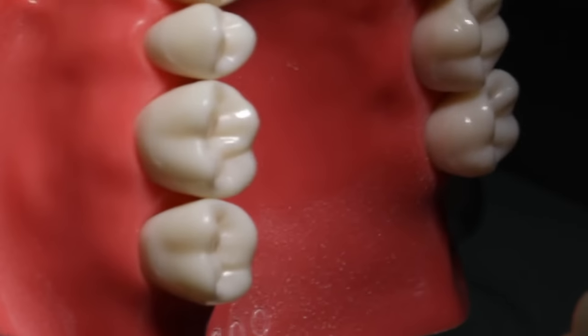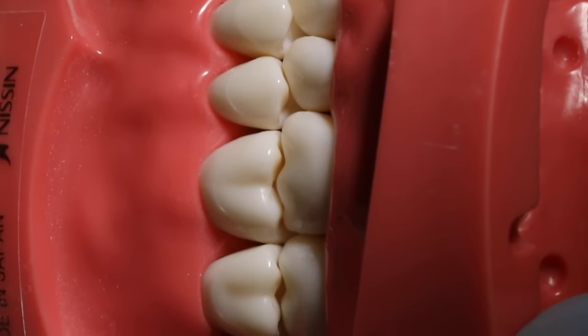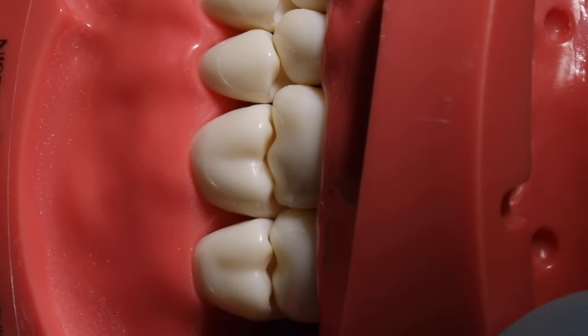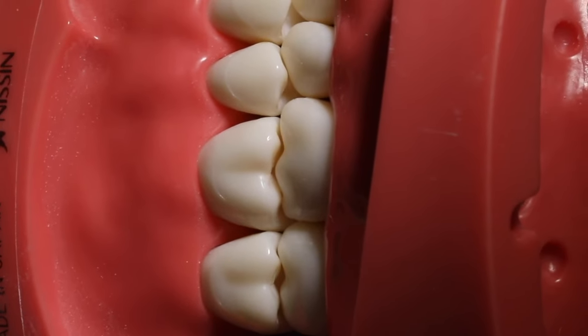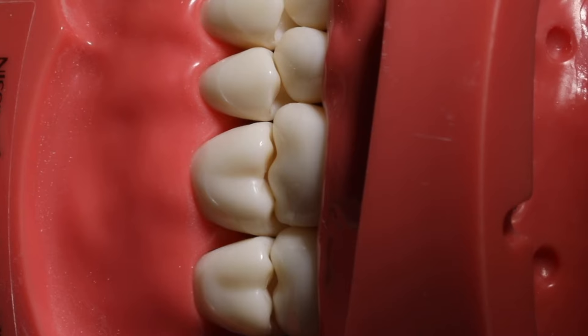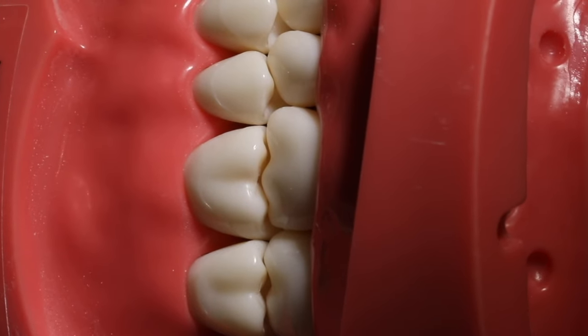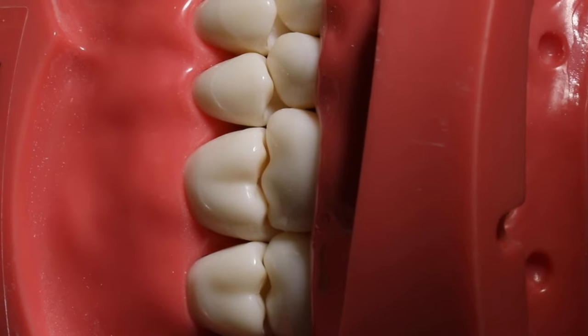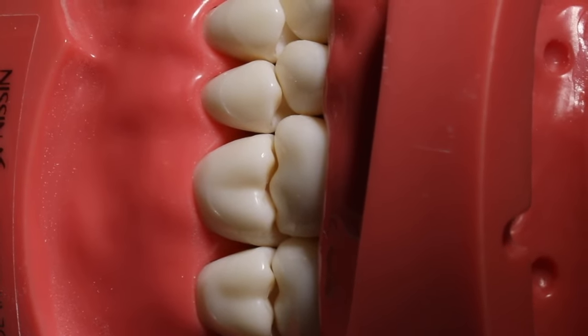So first off, check our occlusion, see what kind of clearance we have with the opposing dentition. Again, this is pretty class one. The cusp-fossa relationship is pretty straightforward. So, yep, universally. The only place there might be, maybe at the distal buccal, possibly, but not bad. It's pretty uniform throughout.